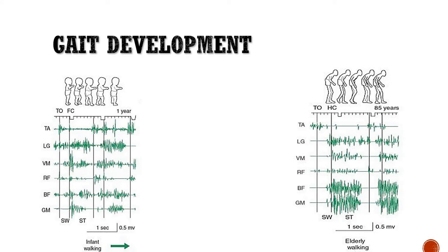You see the gluteus maximus, biceps femoris, huge amount of recruitment, both recruited simultaneously, trying to extend the hip and move the body forward. So from heel contact onwards, most of the muscles, apart from the tibialis anterior, recruited to a very high degree.